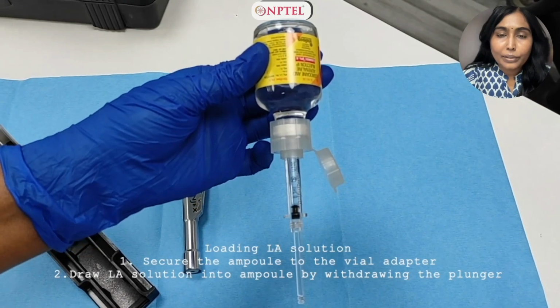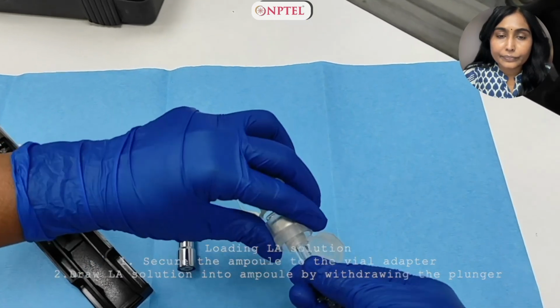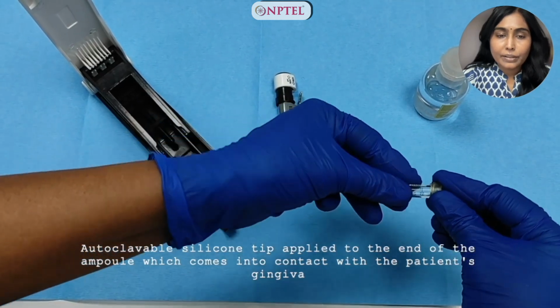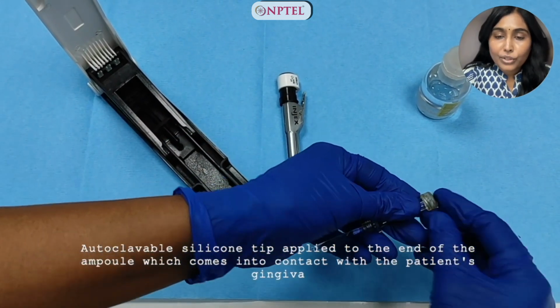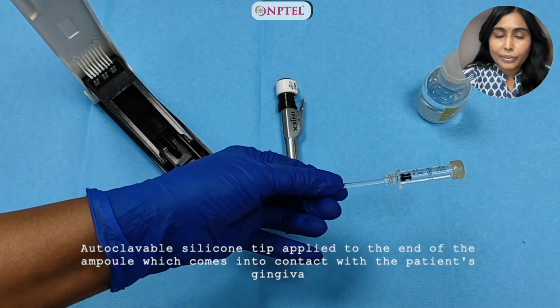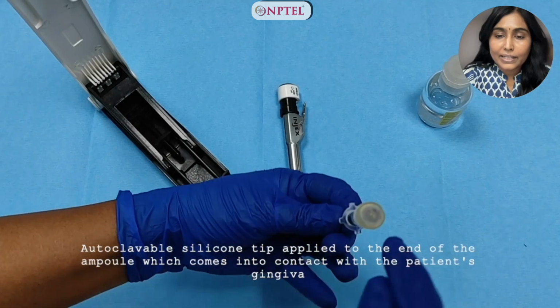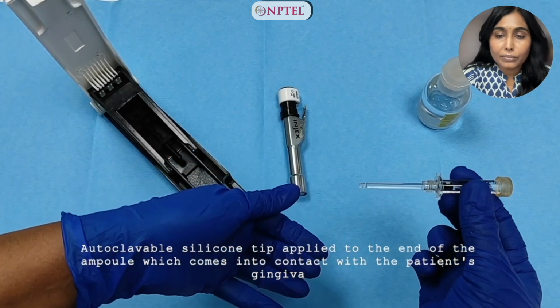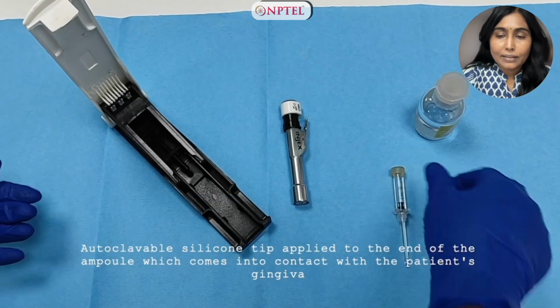That's the ampule fully loaded. Once it's done, you remove it. Now the autoclavable silicone tip is applied to the end of the ampule. Remember, this is the part which comes in contact with the patient's gingiva. It is really soft. You see the nozzle, tiny nozzle.